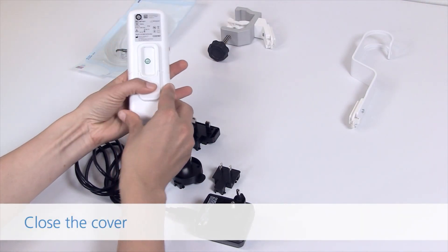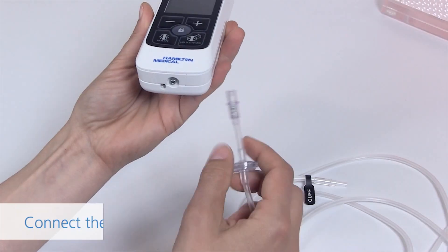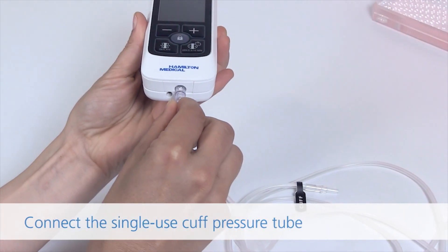Close the cover. Connect the single-use cuff pressure tube.